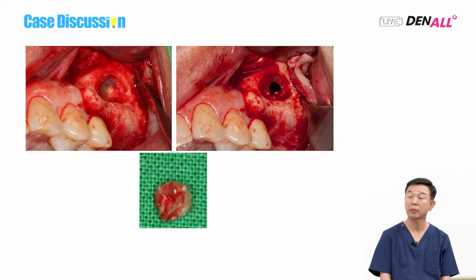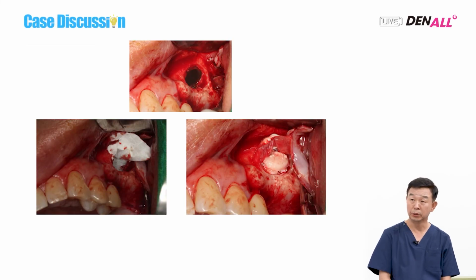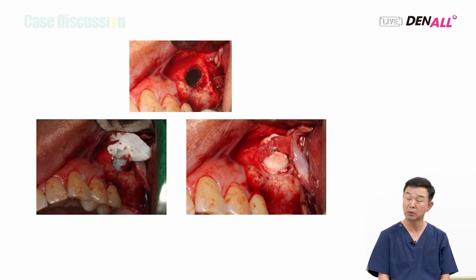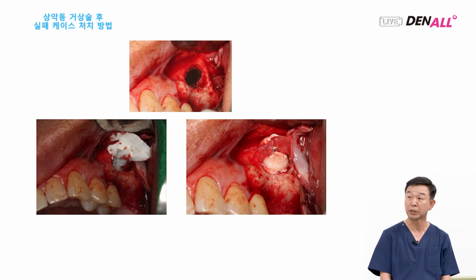For this, like the treatment for sinus membrane tearing, resorbable membrane is used for repair. I use a rather stiff resorbable membrane in this case. If it is not stiff, the collagen is flabby, which cannot be fixed. So bone grafting is done.